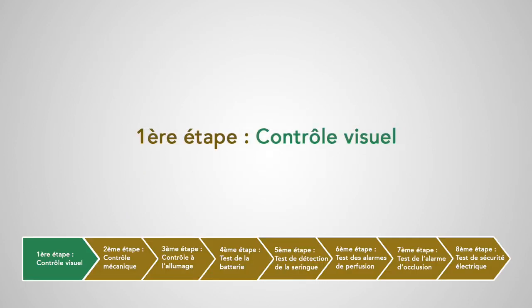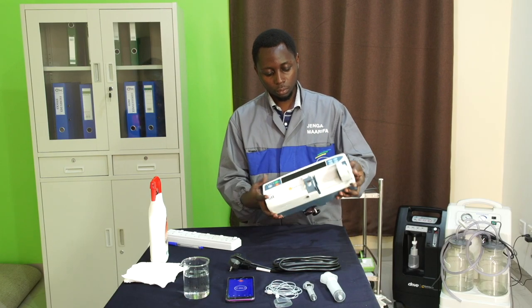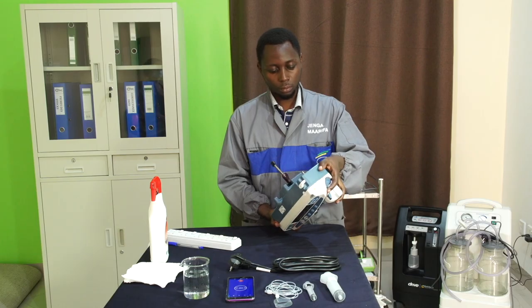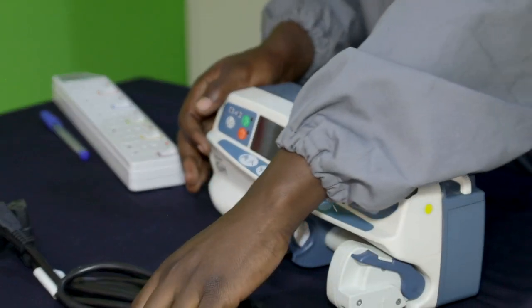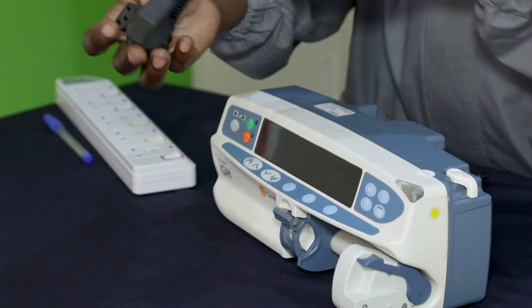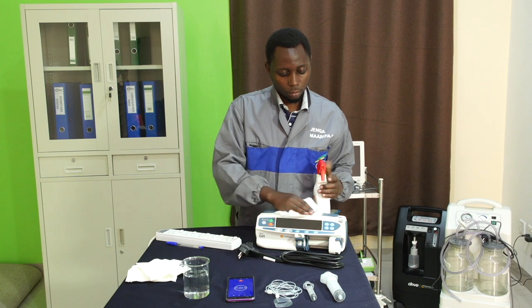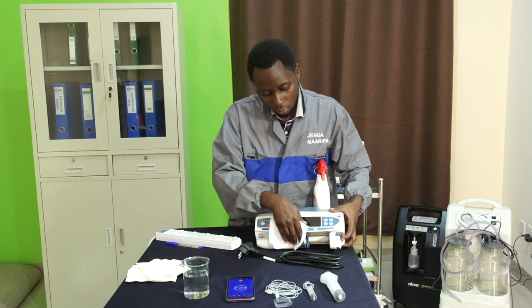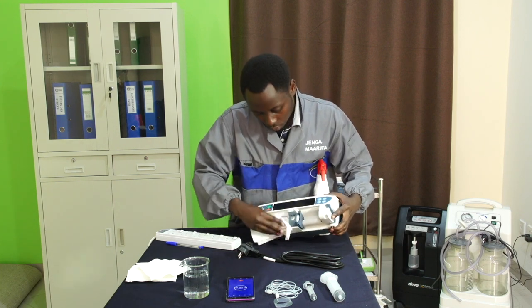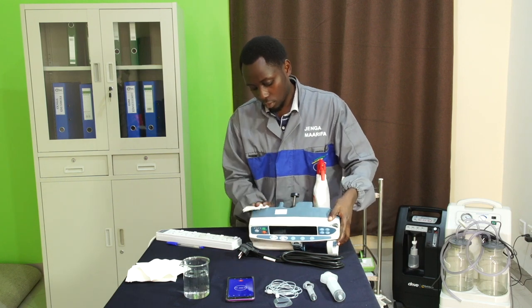Première étape : contrôle visuel. Nous allons vérifier dans un premier temps que notre appareil est en bon état, qu'il n'est pas cassé et que tout est présent : le capot, le cordon électrique, l'écran, la tête d'accroche du piston et la trappe de la batterie. Nous allons ensuite nettoyer l'appareil avec un produit détergent désinfectant approprié aux dispositifs médicaux, ou avec de l'eau chlorée à 0,1%.